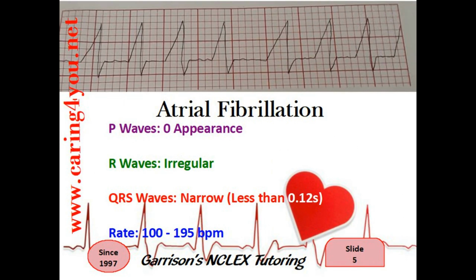Now, here comes the fun part. Identifying strips is not as hard as you might think it is if you just listen to this PowerPoint presentation or this YouTube video, right? So you only have to know 5 strips, 5 possible strips for the NCLEX, and I hope the NCLEX test writers aren't listening to this. But anyway, here they go.